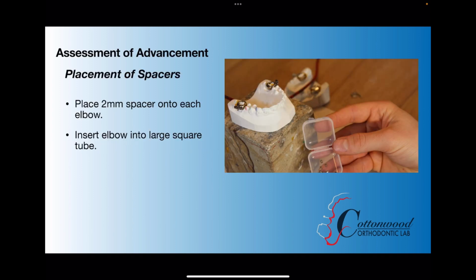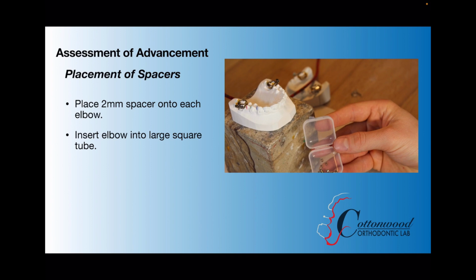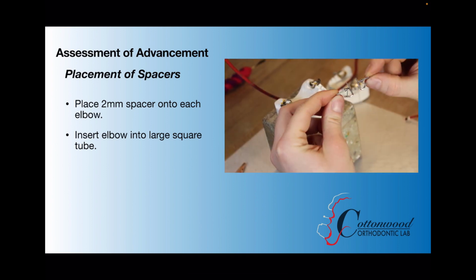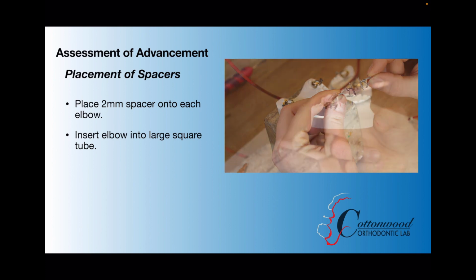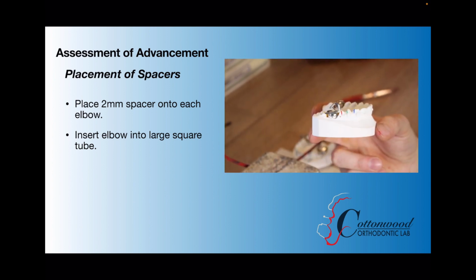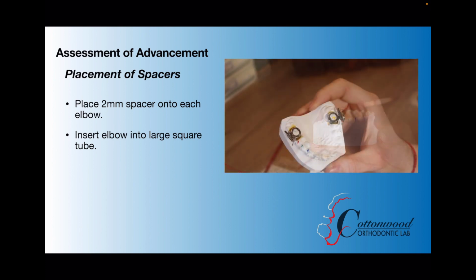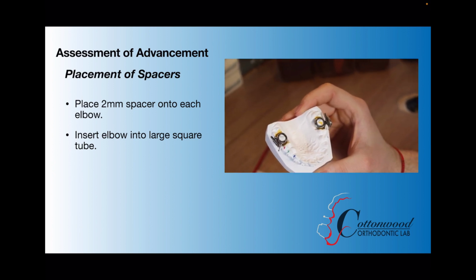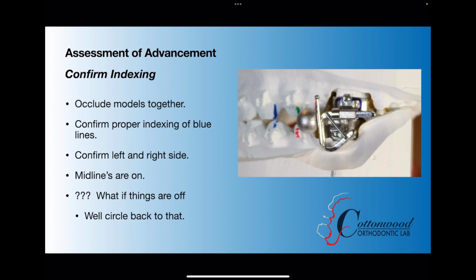So now we can assess our advancement. What you want to do is grab a 2 millimeter spacer and place that on each one of your elbows. Insert your elbows into the tubes, and then you want to occlude the models together and see how your advancement is.